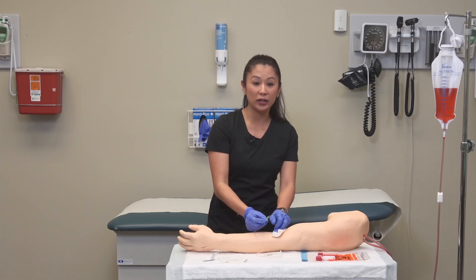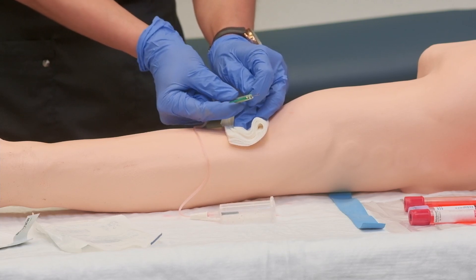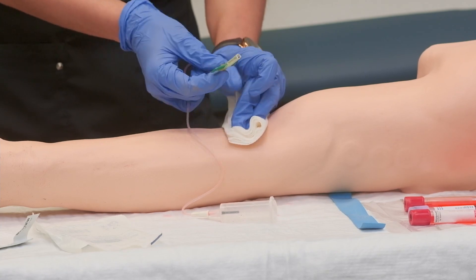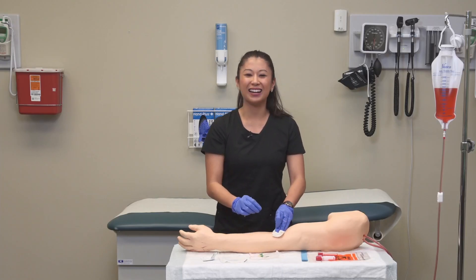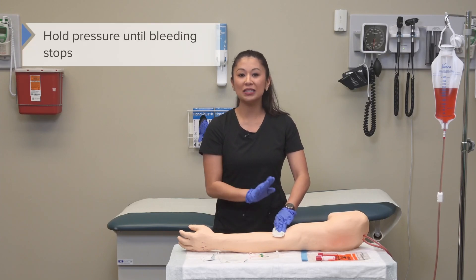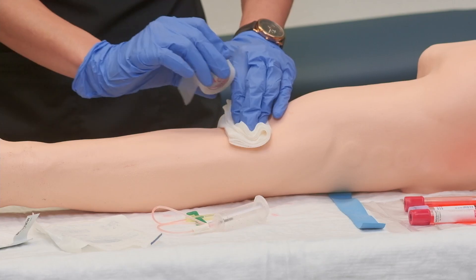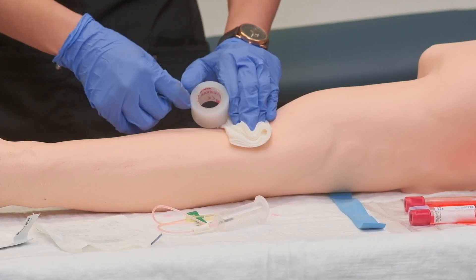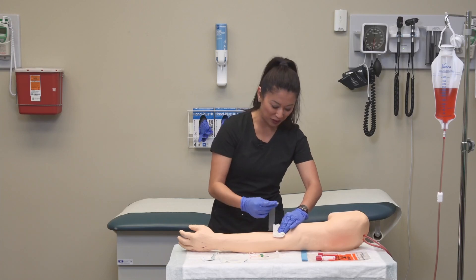To activate the safety device, hold the wings and carefully slide the yellow safety device over the needle until it clicks. Set that aside. Now hold pressure. Once the bleeding has stopped, it's a good idea to tape down the gauze. If your patient has another hand available, they can help you here as well.